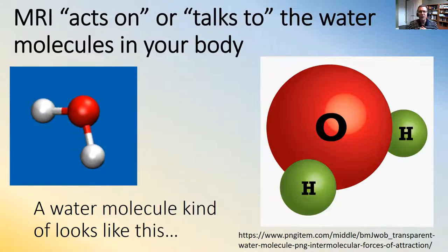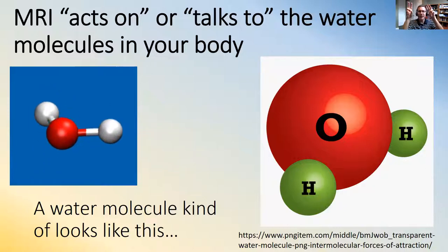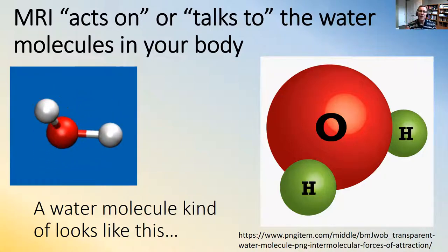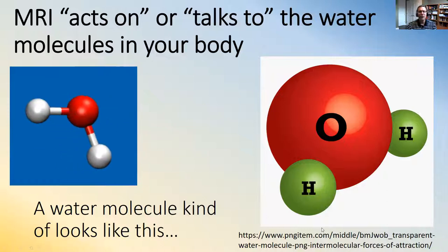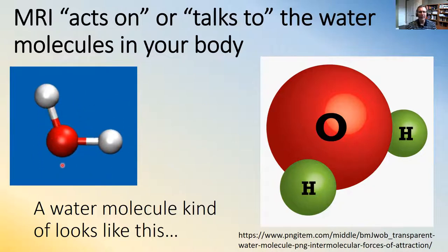Okay. First bit of physics and chemistry you need to understand. MRI acts on, or I'm going to say it talks to, the water molecules in your body. And we've already seen that there's a lot of them. So what is a water molecule exactly? Well, a water molecule is one of the smallest structures going on inside your body. It kind of looks like this.